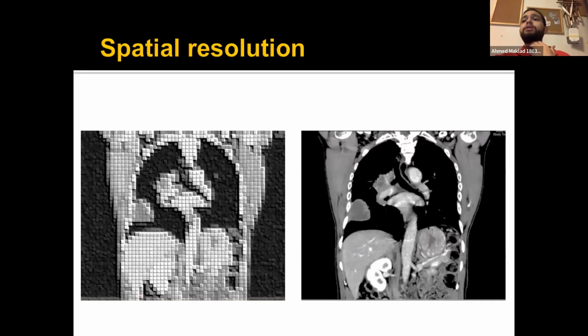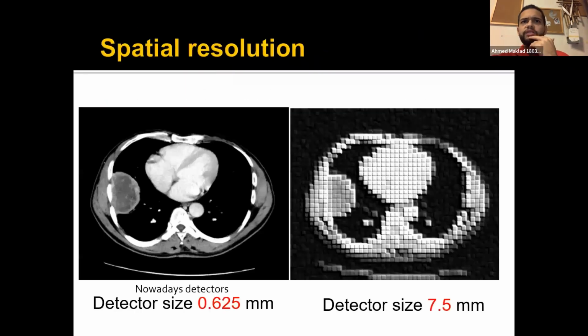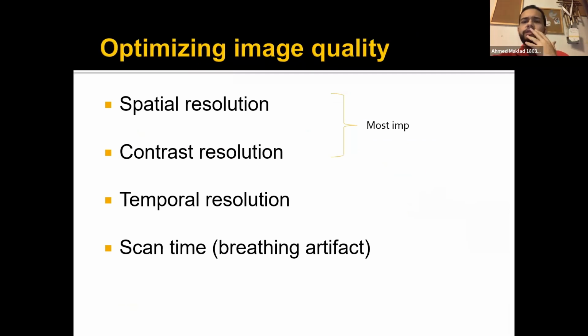So just again, did we do scan time? No, I'm going to go through it. Scan time is not that. Yes, spatial resolution is basically the pixels part of yesterday's lecture. If you remember that, that's spatial. And as you can see right here, pixels, right? No, we did not do scan time. I'm not sure if it's explained. Yeah, it's not explained.